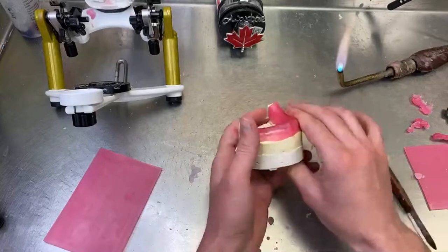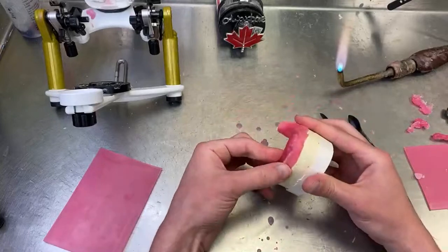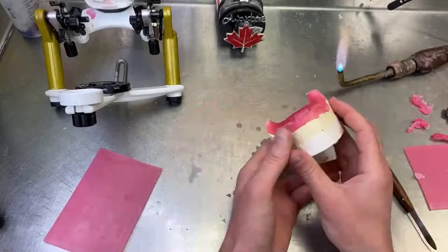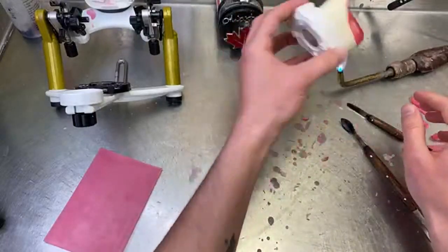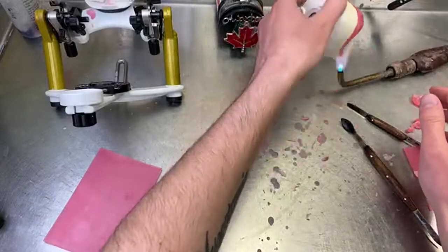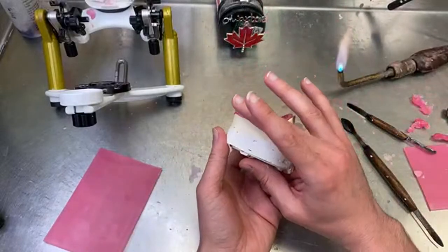How long does it take for you to arrange all the teeth? It would take about 20 minutes for upper and lower, but because now I'm just talking and looking at the screen, it takes longer than that.